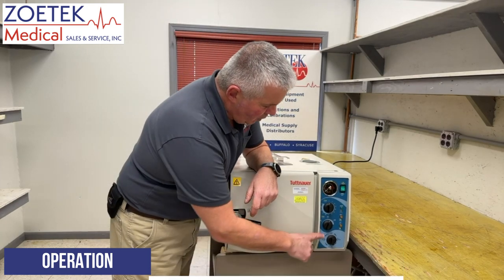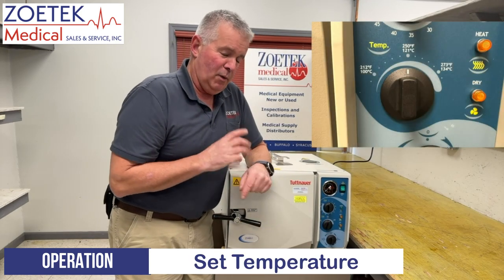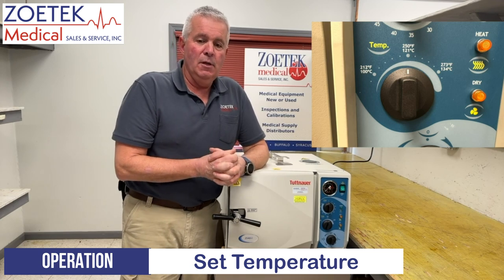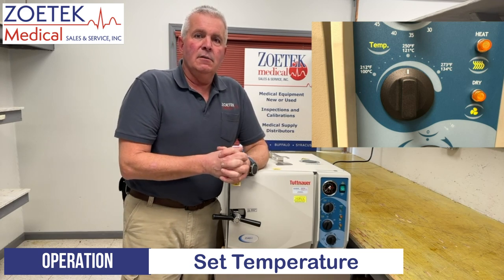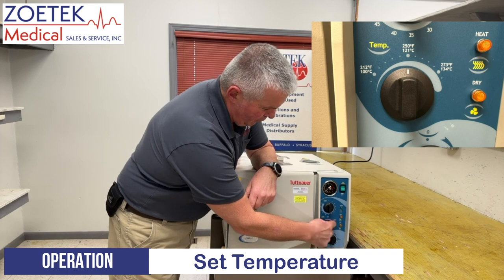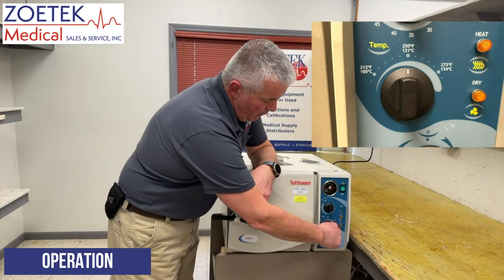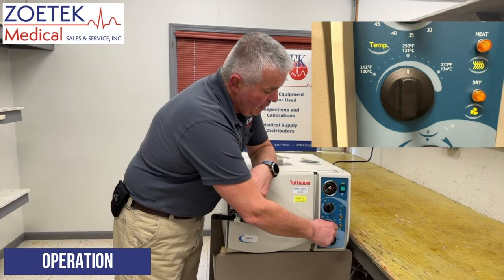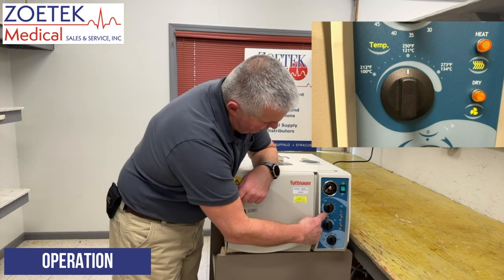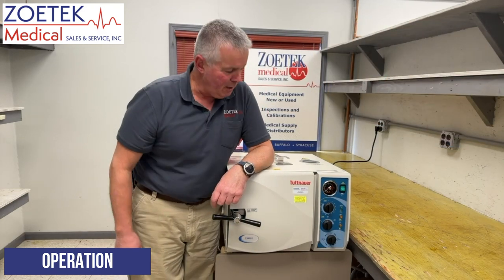At that point we want to decide what temperature we want to sterilize our instruments at. You would reference whatever your facility policy is for that. Typically you'll be between 250 and 270 Fahrenheit, or 121 and 132 Celsius. You can turn the second knob from the bottom — this is your temperature knob — to the point where you want it. So if we want 250°F, we go to the straight-up 12 o'clock position. If you want a higher temperature, you turn it clockwise.